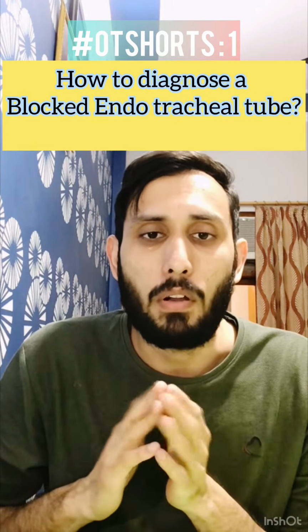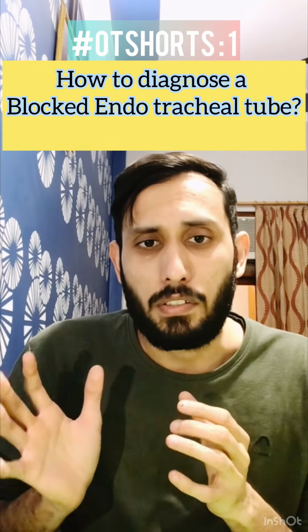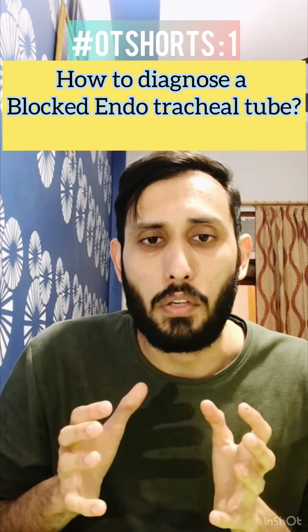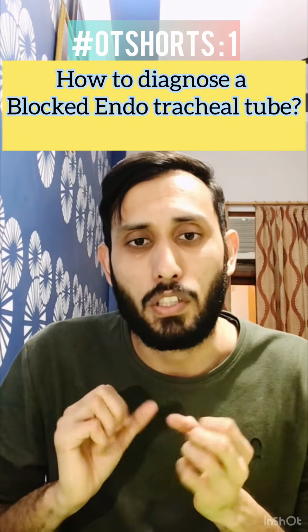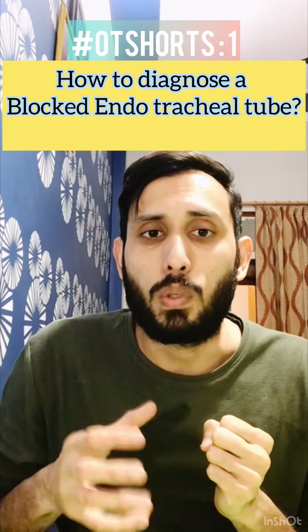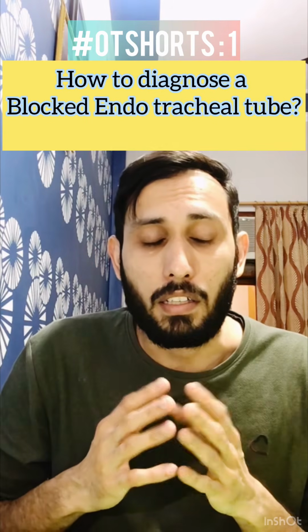If it is partially blocked, there is some air entry and you don't know the baseline peak pressures and end tidal CO2, you still have time. You can put NS, 3 to 4 ml of NS, give some positive pressure through the ambu and try to suction the tube. Thick purulent secretions will point towards the tube again getting completely blocked.